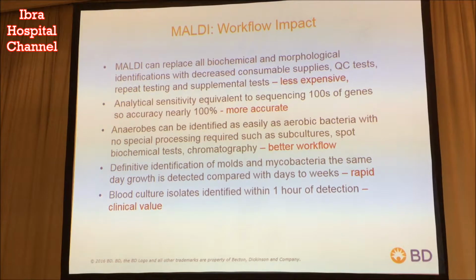For the molds and mycobacteria, we used a different extraction procedure in order to release the basic proteins that you were looking at. But the essence was that for the molds, we were able to identify a mold within an hour of seeing its initial growth on a plate. The mycobacteria, it was the same thing. So it totally changed the way we did microbiology in those two areas of the lab, because now we had definitive identification and didn't require a skilled technologist to recognize the structural features of a mold or take weeks before you had a mycobacterial identification.